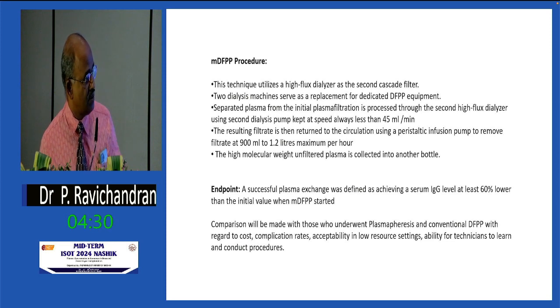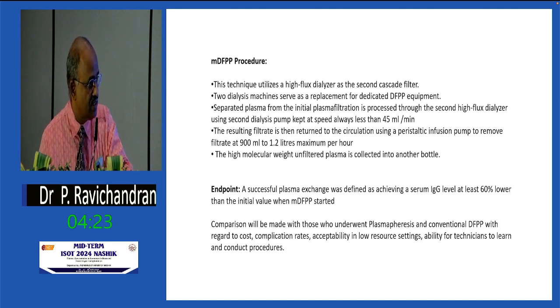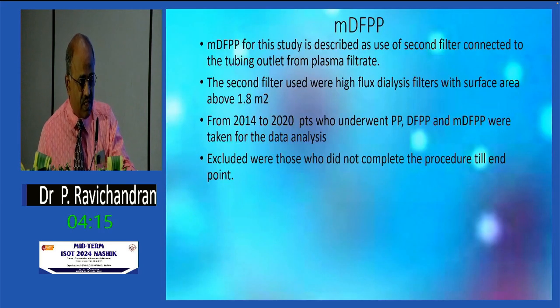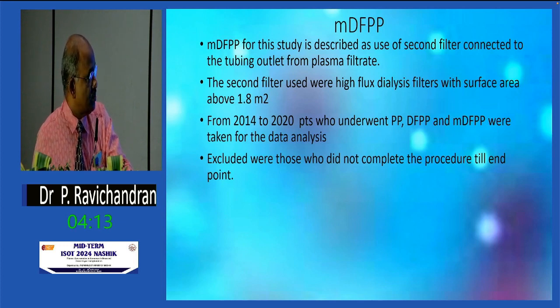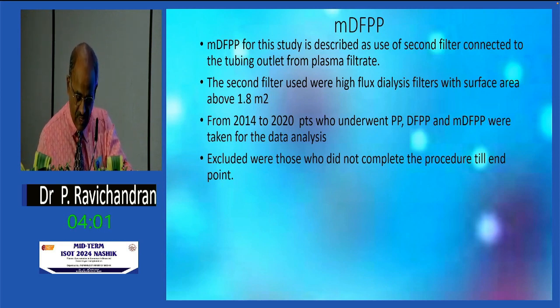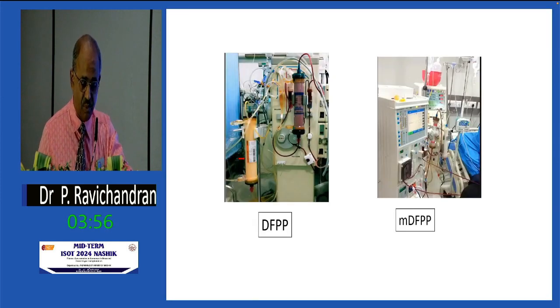And the most important thing was whether we could take this to lower resource settings, especially in the Northeast or in African countries where procedures were denied and patients had to travel all the way to India. So in this study, we used a second filter connected to the plasma filter, and commonly available 1.8 square meter filters were used, and data between 2014 and 2020 was analyzed. And of course, we excluded all those who could not complete these endpoint procedures.